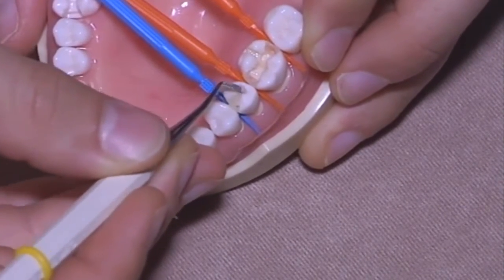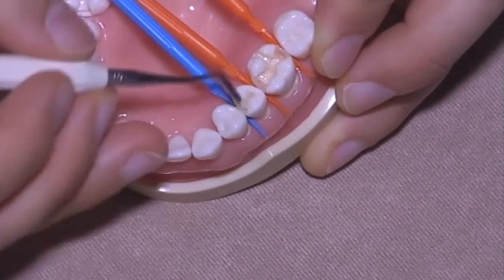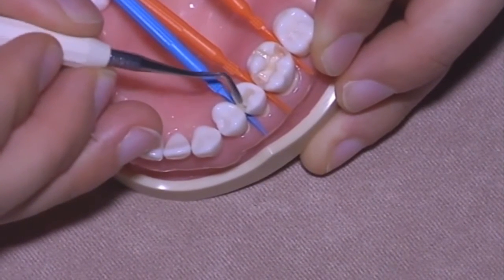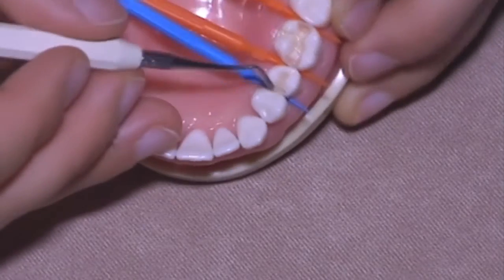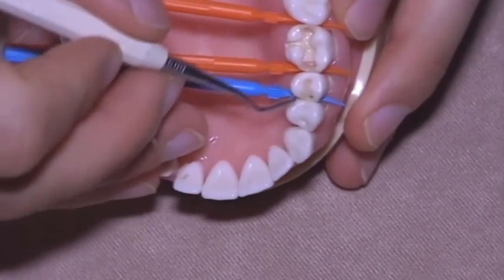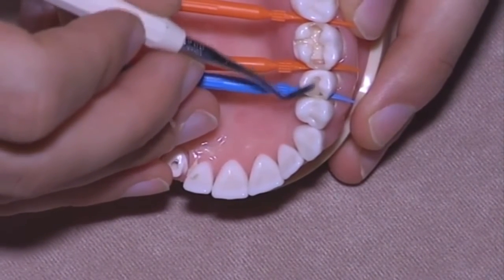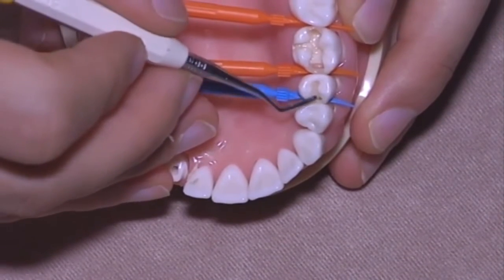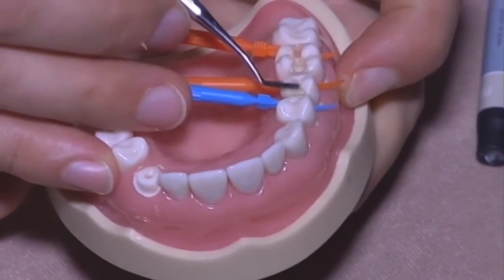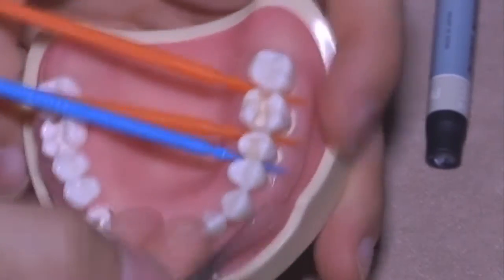So first I shape the palatal side of the cavity, and then I will shape the vestibular side. With the spatula, usually we have already the tooth telling us the anatomy. So just follow the anatomy like this, placing the first layer of composite.